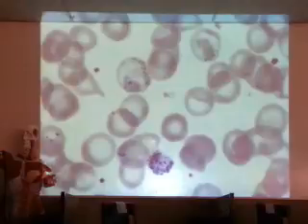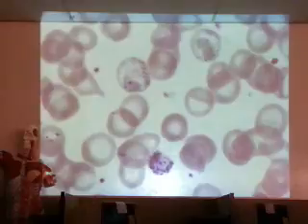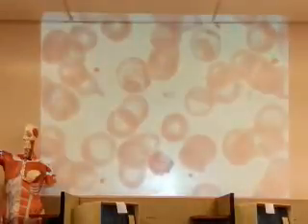They're just fragments. Red cells, if they're damaged, you can have little pieces of red cells floating around. It could be like fragments of glass or something. Any other questions? Ask questions now, because he's probably more knowledgeable than I am.